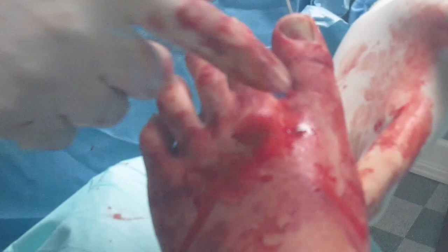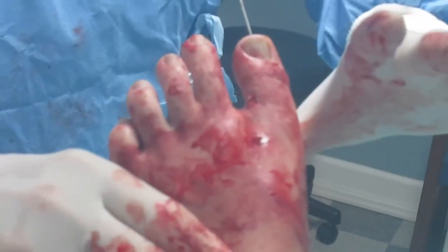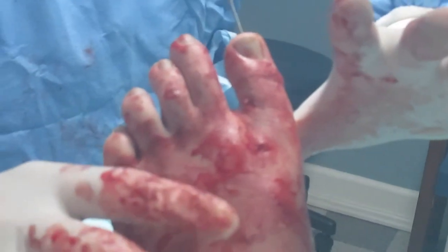We've gotten the hump out. The osteotomy is gonna serve two issues here. So I also moved the toe into a more erect position, and also allowed me to take a wedge out plantarly to straighten out the hammer toe as well. So I actually corrected the hammer toe, Hallux Varus, and also got her foot in a more anatomically better position.